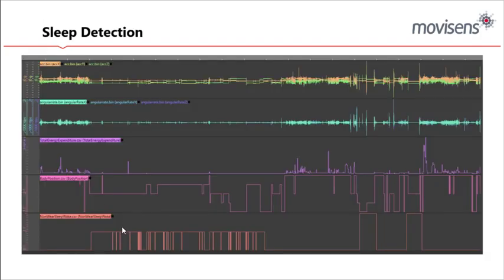Sleep detection. So here we can see the differential between non-wear and sleep-wake, and examine the body position. So we have our acceleration signal here, and it's being used to derive these different elements based on the spectrum that's happening close in here. And if we looked in very close and detailed, you would actually see very subtle rhythmic rising and falling of different axes on the accelerometer, which is the body breathing. It's the expansion of the rib cage. That is how we know that the sensor is still being worn on the body. And you can see these little subtle moments where the body's changing position or rolling around or moving. And this was a relatively restless night. Obviously, you can see a lot of little phases of waking up or excessive movement. Like this is probably a potential quick trip to the bathroom because they've changed body position.